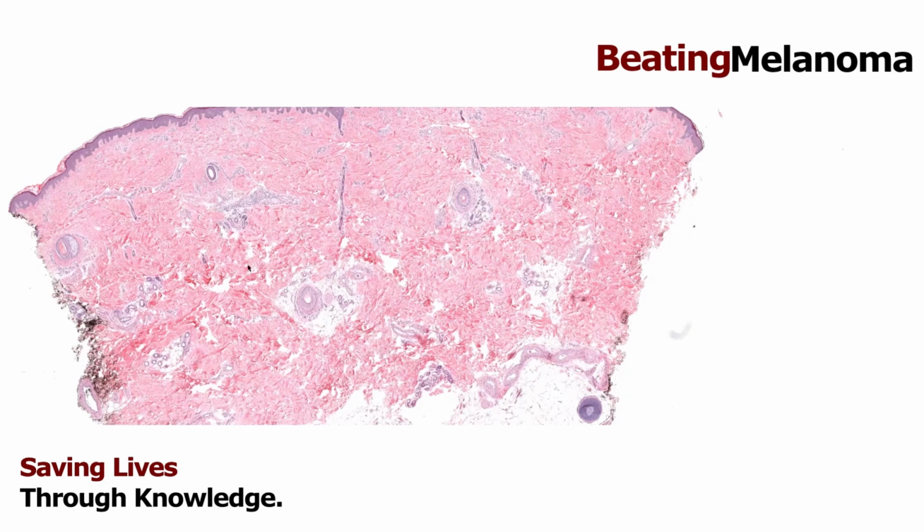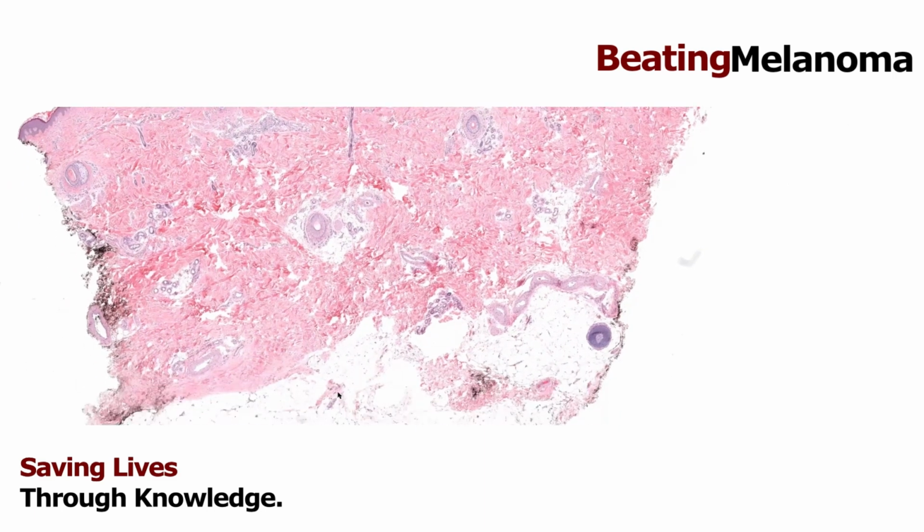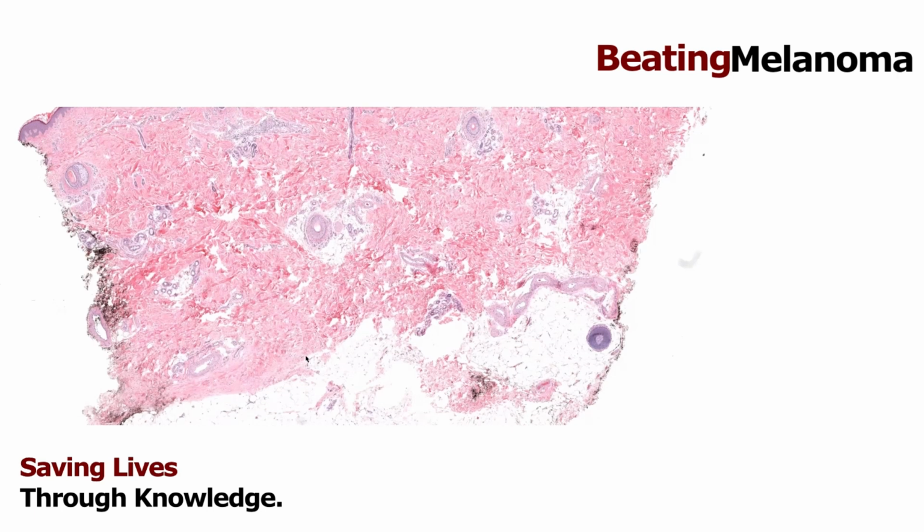The dermis supports the epidermis, and then down below that we have a layer of fat, this white layer at the bottom. That's called the subcutis. Or some people say the hypodermis, like you may have heard of a hypodermic needle. I usually call it subcutis, but some people call it hypodermis. But in any case, that's the layer of fat that's down below. And then way down below that, we don't see it on this slide, would be like the skeletal muscle and then the bone if we were going all the way down. But here, we're just going to focus on the skin today.